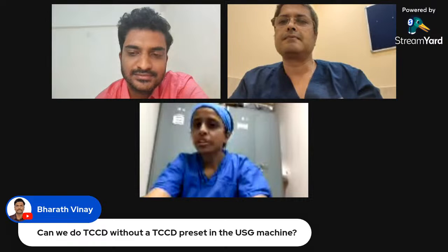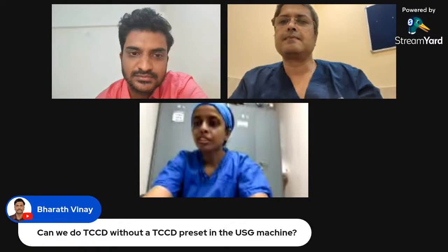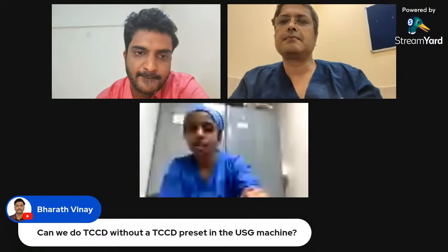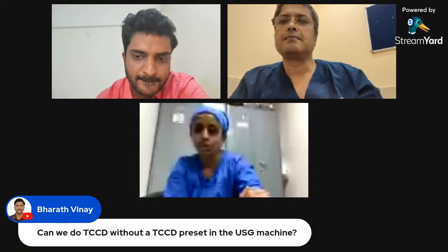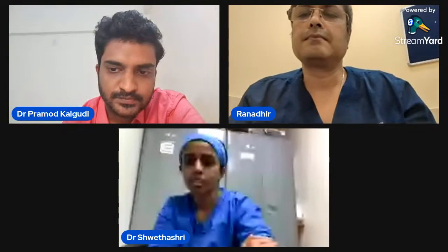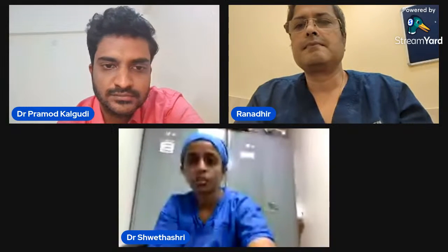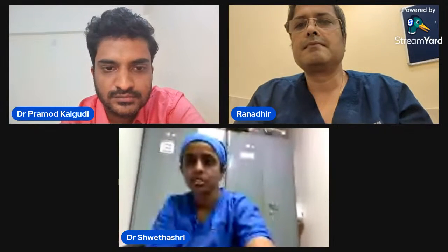Ideally, we require a TCCD software in situ. However, if that software is not there, we can still do it on a cardiac preset. Of course, it's not an ideal situation, provided the harmonic imaging is totally turned off, wherein ideally the harmonic imaging is on. The whole purpose is to delineate the deeper structures in the grayscale.